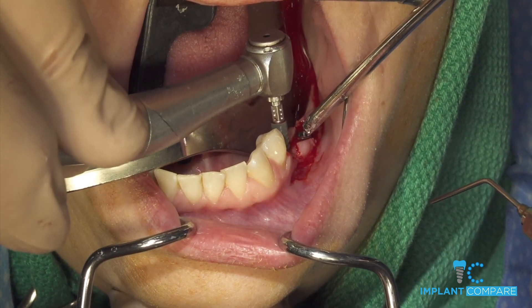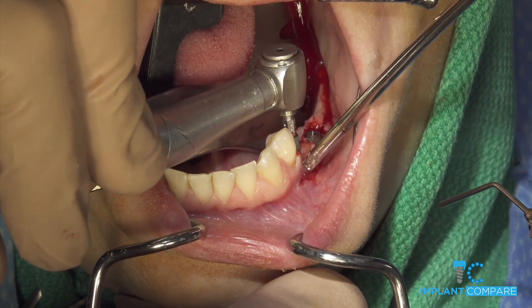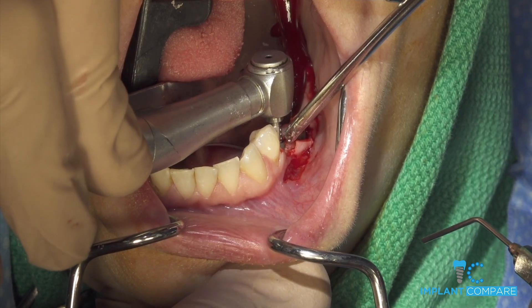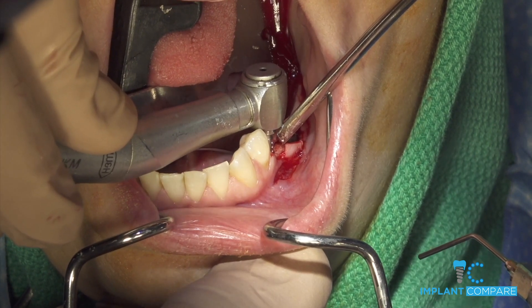There we go, all right, and so that's going to go in. Again, we're going to try to drop this. I put these in with the drill motor starting at 35, then options include either going up on the drill motor torque or finishing it by hand, and I kind of prefer that route so I can feel the kind of torque we're achieving.